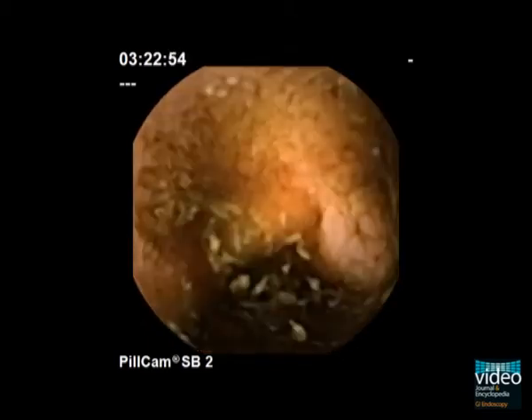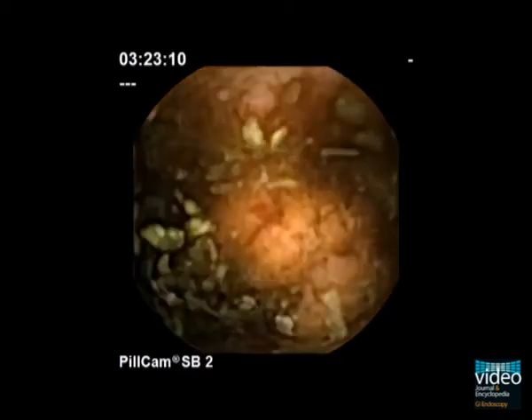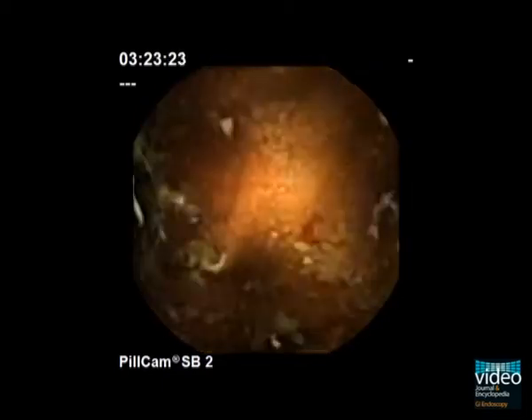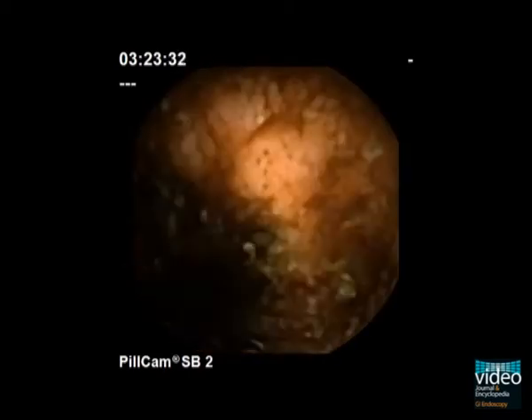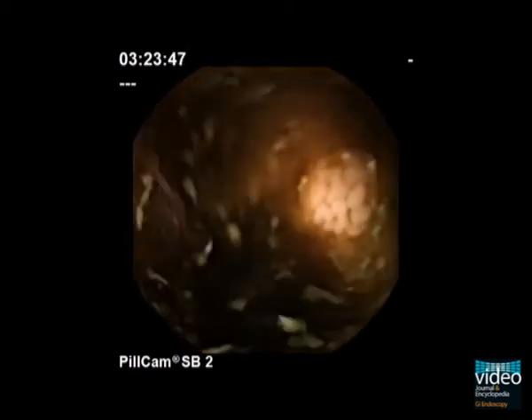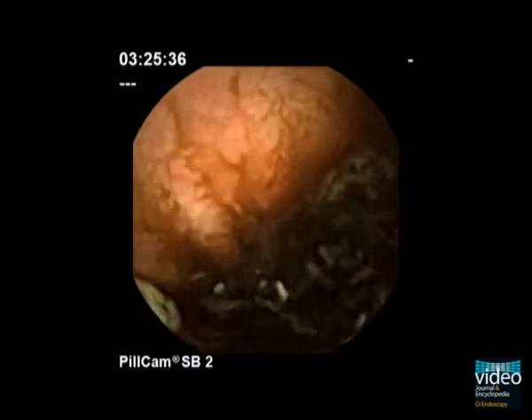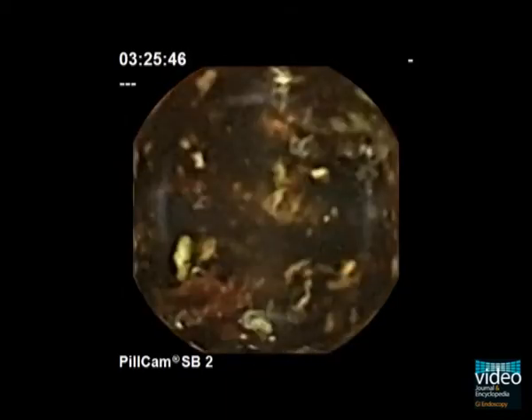The capsule shows small ulcers within enlarged small bowel villi at the distal third of the small bowel. Intestinal content encumbered visualization of the small bowel mucosa. Increasing impurity might be a predictor of a functional stenosis in the distal small bowel.